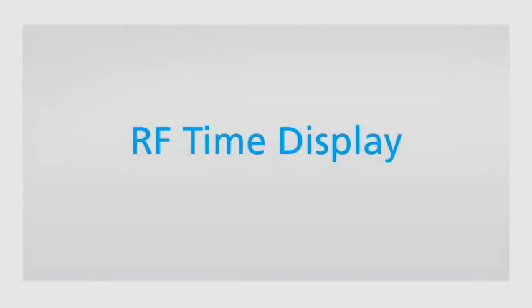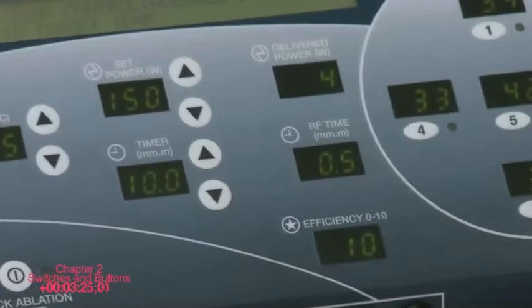RF time minute display. Displays the total time the RF power has been on to a resolution of 1/10 of a minute. The display resets to 0 at the onset of a new RF energy delivery cycle. An RF energy delivery cycle is considered to be complete if in the previous cycle the timer reached 0 or if the mode is changed.